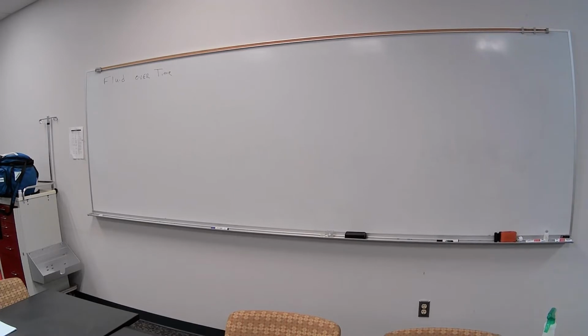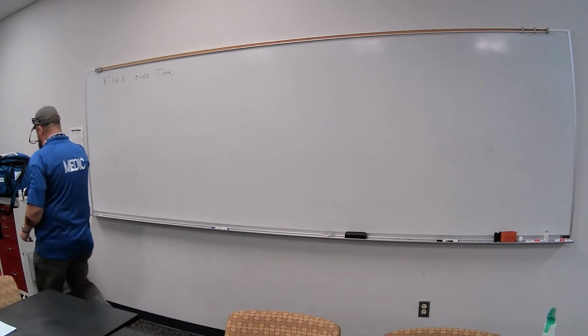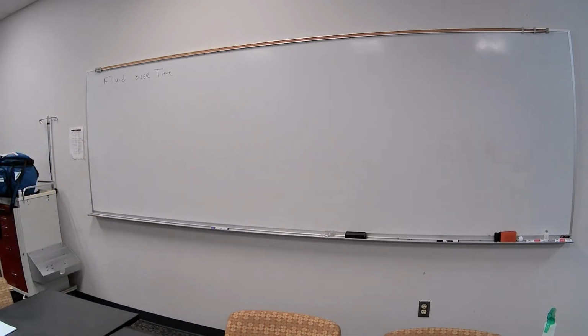Alright, so the first thing we're going to talk about today is setting drip rates and basically fluid over time. When we talk about fluid over time, there's a couple things that you need to know. The first thing you need to know is your drop set.